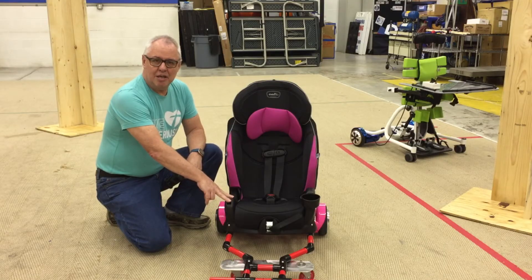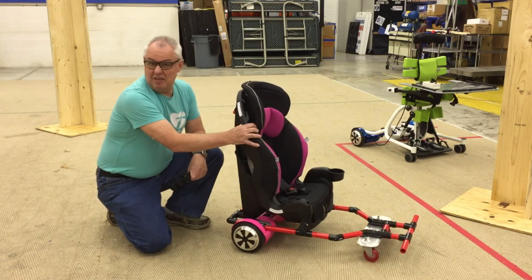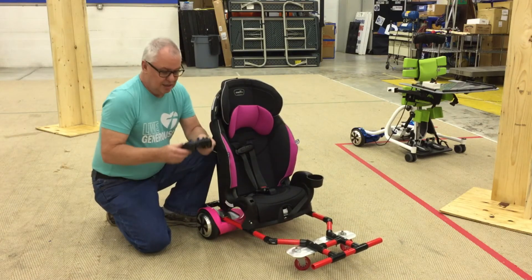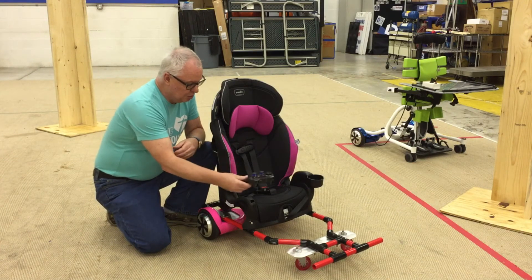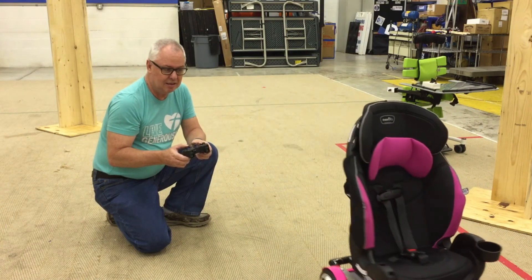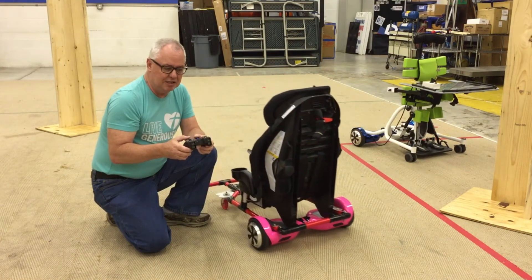This prototype shows a mobility device built from scratch for a very low cost. This unit uses a commercial CASI seat at $75, a modified hoverboard at $100, and has a frame made out of furniture grade PVC. This unit has a wireless controller. My circuit has been built into this controller. Normally this would be mounted somewhere on the unit depending on the child's needs, but you can see that it's also quite mobile. Once again these can be adapted to any speed depending on the child's experience and capabilities.